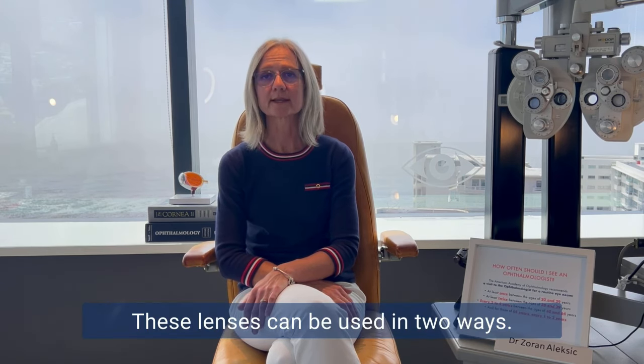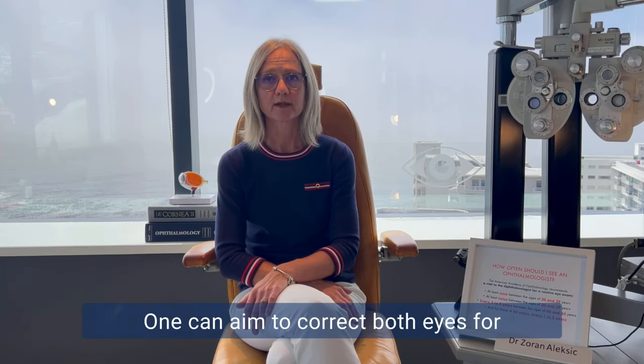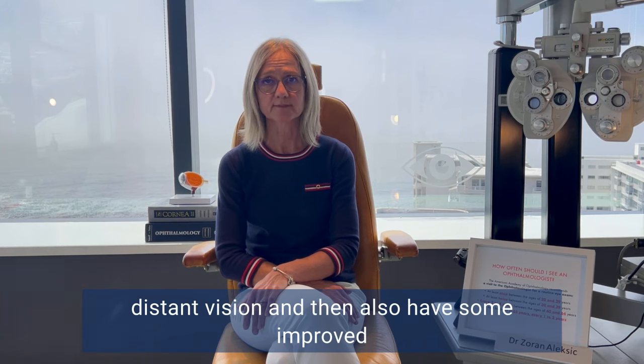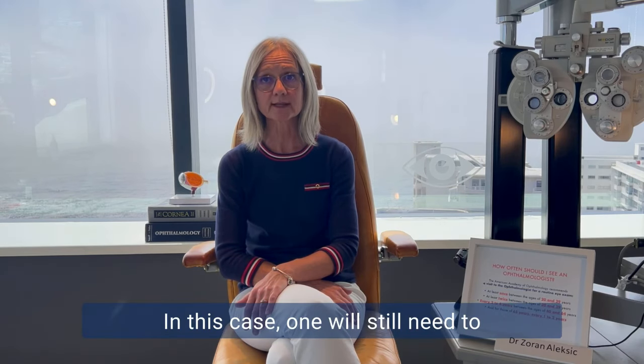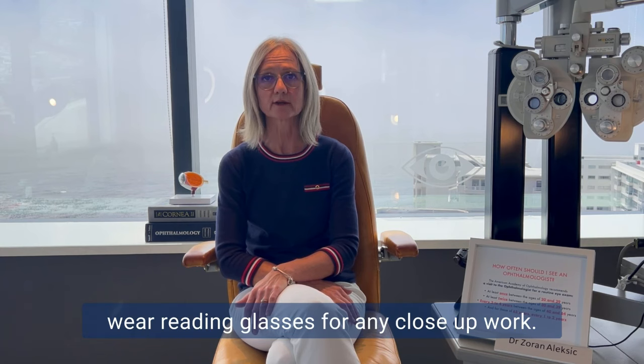These lenses can be used in two ways. One can aim to correct both eyes for distance vision and then also have some improved intermediate vision without the need for glasses. In this case, one will still need to wear reading glasses for any close-up work.